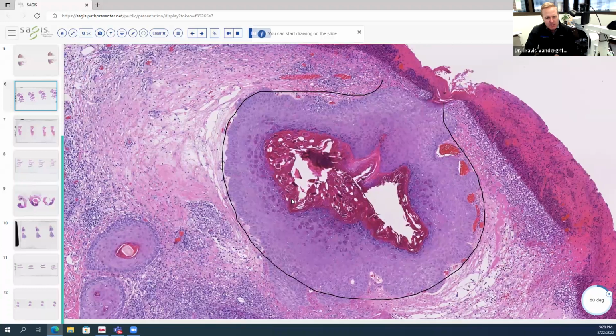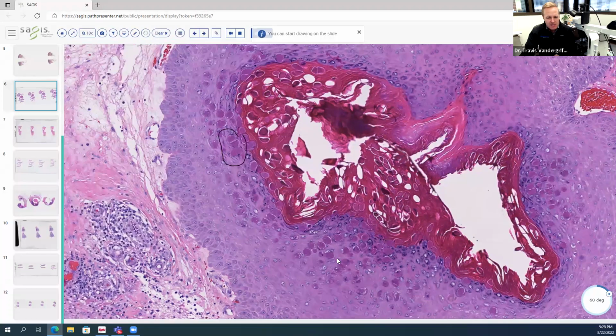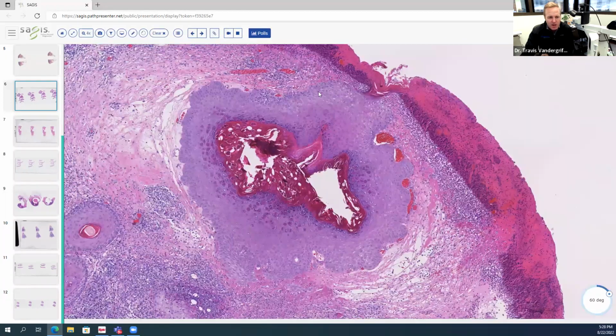And in that cystic space, the lining is showing an intracytoplasmic inclusion that is eosinophilic. It's an eosinophilic inclusion that compresses the nucleus of the cell off to the side. And as these cells mature and come to the apical surface of the epithelium, those inclusions are shed out into the cornified material. These are molluscum bodies, and this represents a concomitant and probably coincidental papule of molluscum contagiosum.